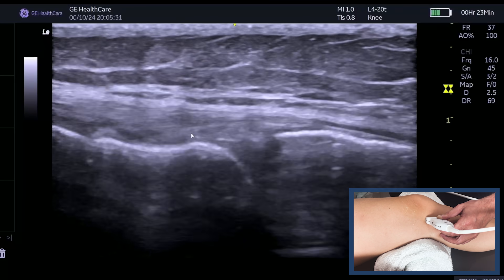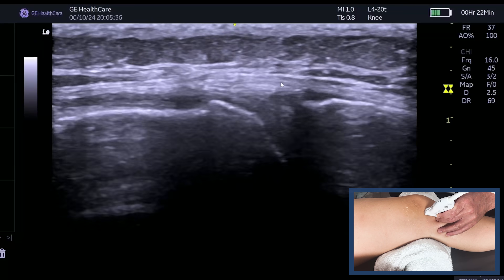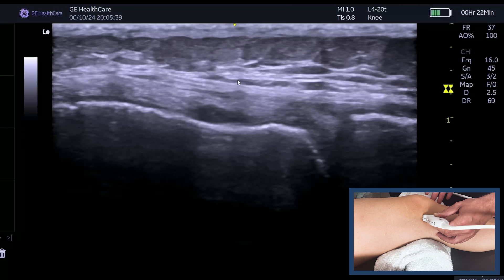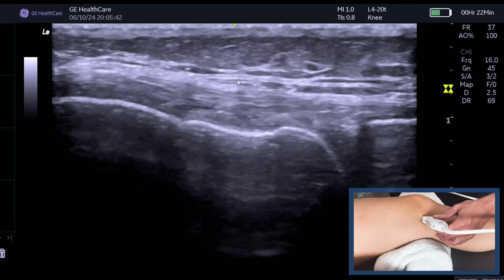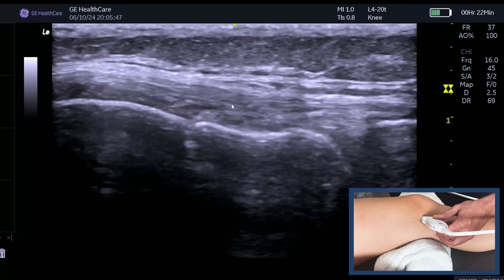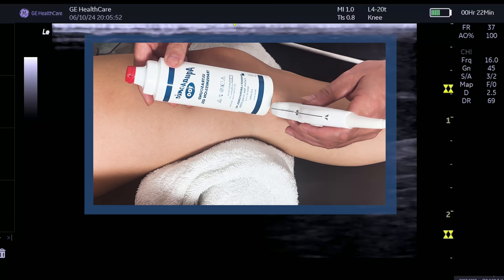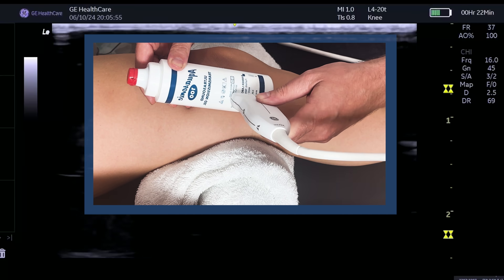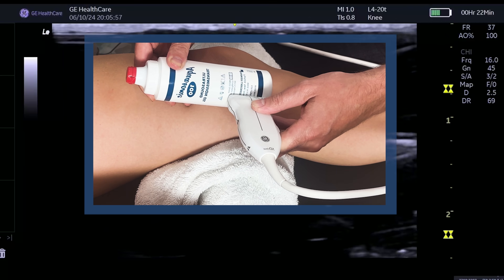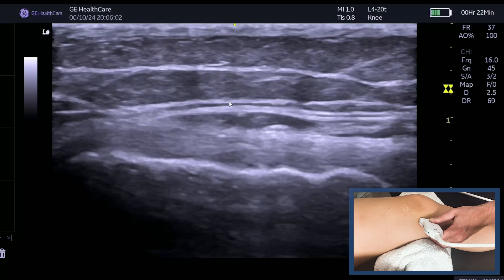These deep fibers link into the meniscofemoral and the meniscotibial ligaments, forming the deep capsular layer of the MCL. The key learning point: don't come too anterior — that is not the MCL. You need to bring the probe around the back, almost pushing into the back of the tibia, probably more posterior than you think, to get that really nice fibrillar pattern. If my gel bottle were the femoral condyle, I'm coming around the back and almost pointing up back towards the femoral condyle.